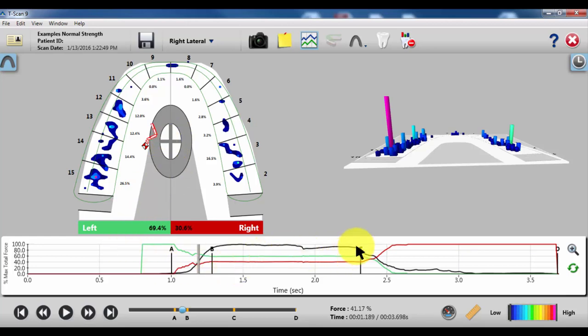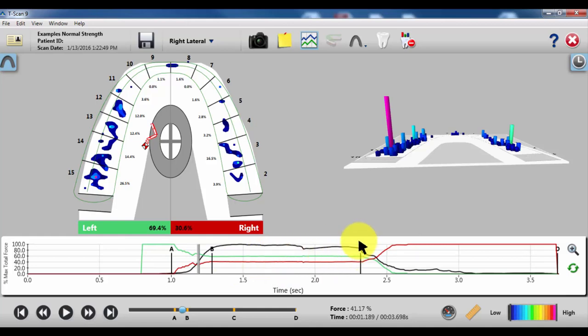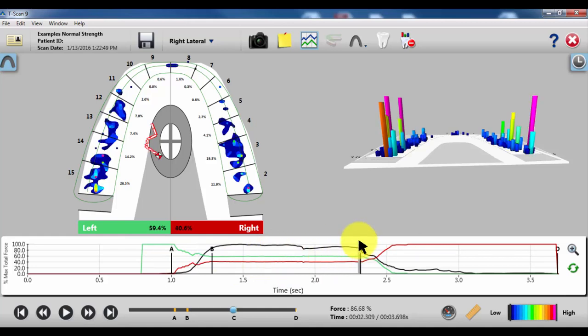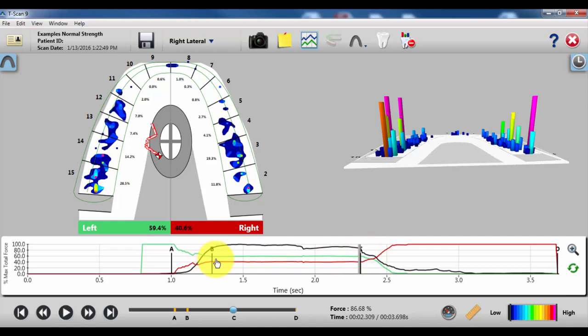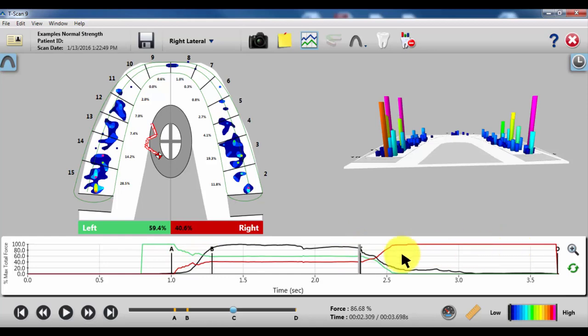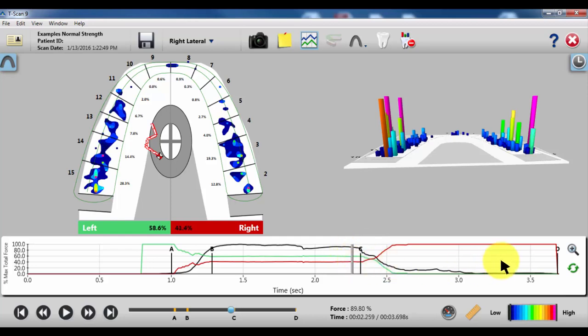Now the other thing to look at is, in this case, we have the person slide to the right side. Just using T-Scan with excursions, it's like when we were balancing. Instead of starting at A to B and walking through, you start at C and you walk through D. But one of the important features here is you want to know what you're looking at, and so sometimes you have to adjust this D line.